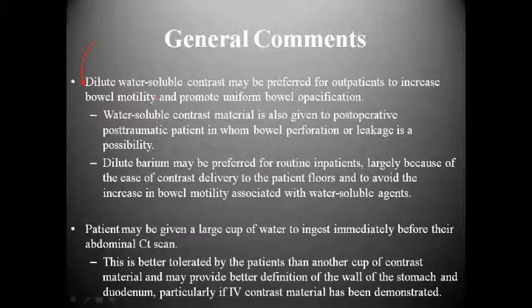basically drink barium. I think back to probably about a year ago, I had a lady come in. She was having severe abdominal pain. First, I shot an abdomen flat and upright, and the abdomen flat and upright, I really couldn't demonstrate anything.